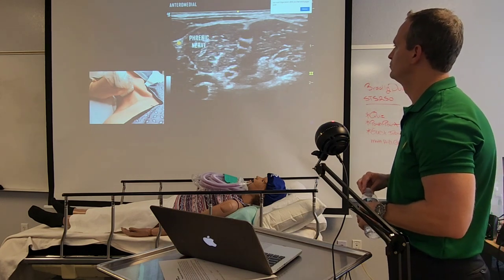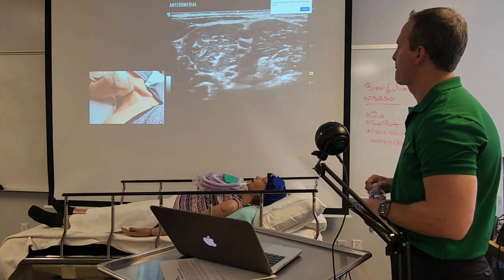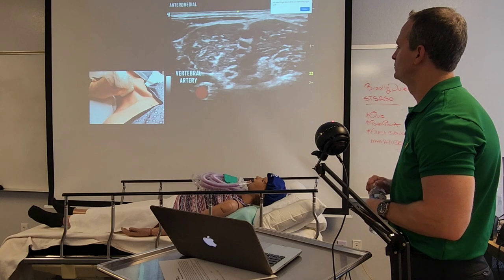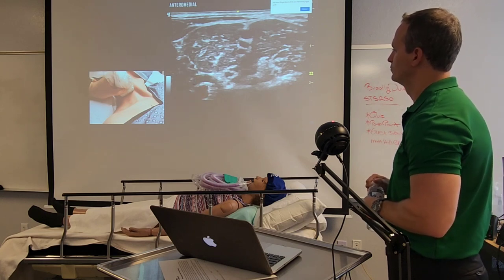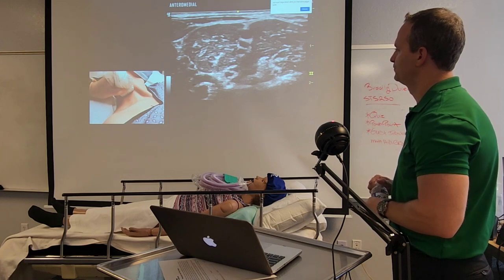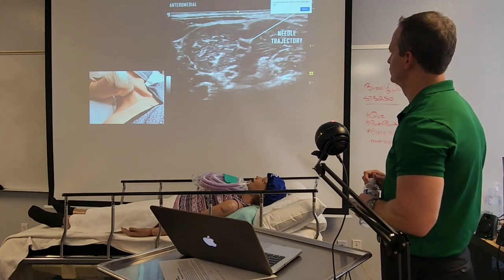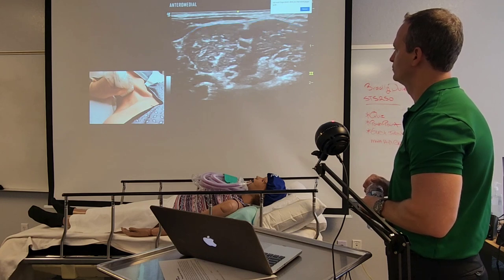The phrenic nerve is located anteriorly to the anterior scalene muscle. The vertebral artery can also be identified. The neck is highly vascular and color Doppler imaging is often helpful to avoid vessels. The needle tip should be directed from lateral to medial in between the nerve roots to avoid accidental nerve root injury. A subtle pop is elicited as the needle passes through the prevertebral fascia.